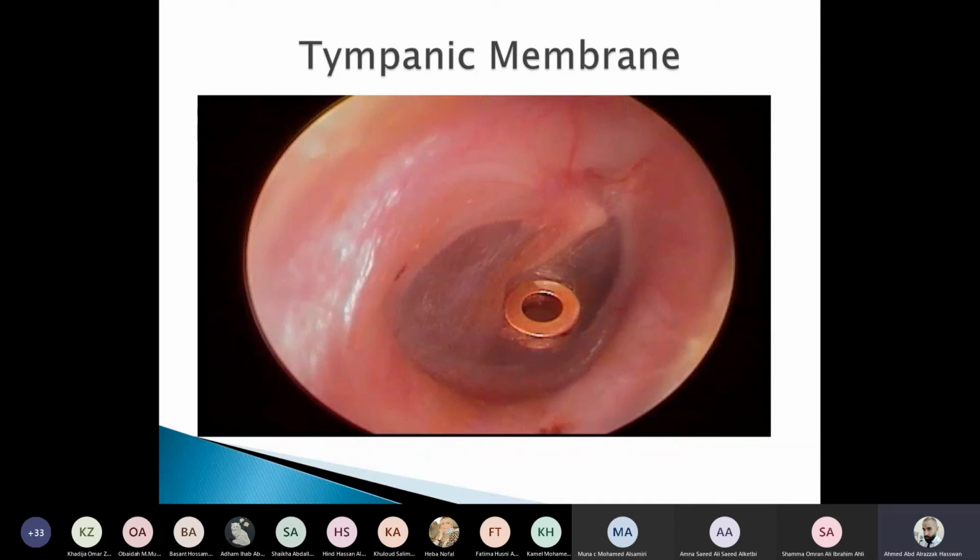So do you think this is a case of a child maybe who has put something, a foreign body? Okay. So yes, I agree with you. You're perfectly right that this is a foreign body, of course.